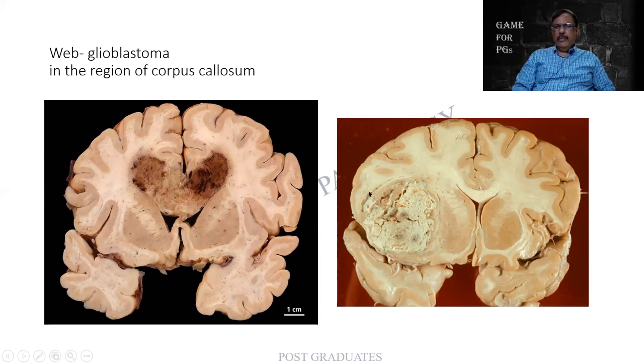The advantage of a brain tumor is, even when it is benign or sometimes in early malignancy, when it grows, it causes a tremendous amount of pressure so that the patient will not be able to withstand it. He is rushed to the hospital and an earlier diagnosis done, unlike other tumors which would have already gone in for grade 4. So this is a tumor with areas of necrosis.